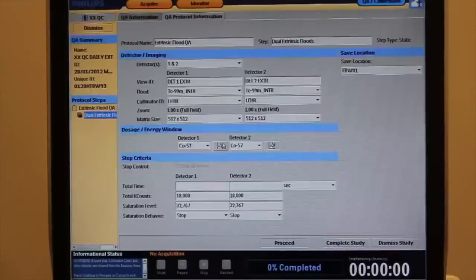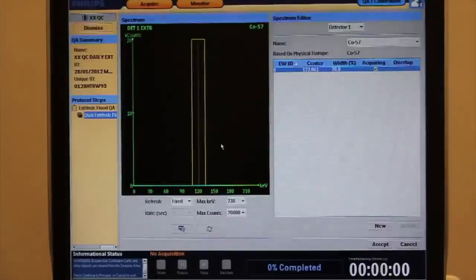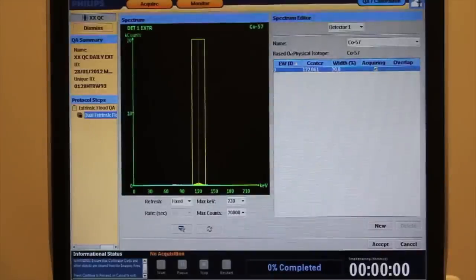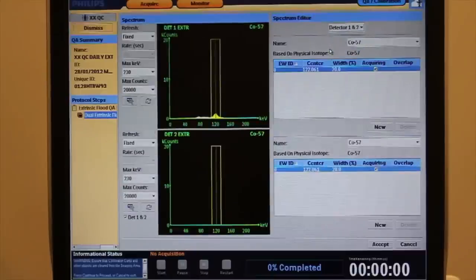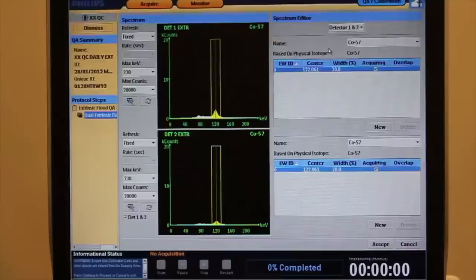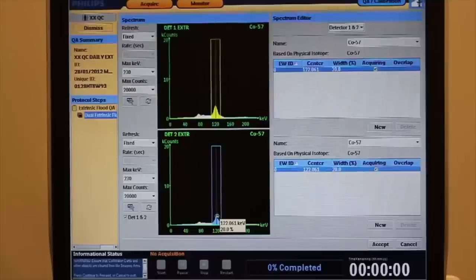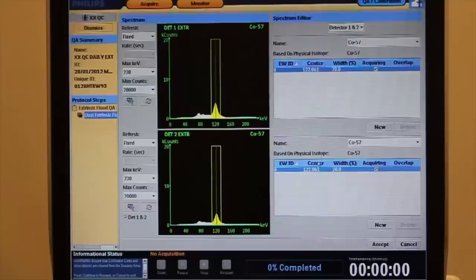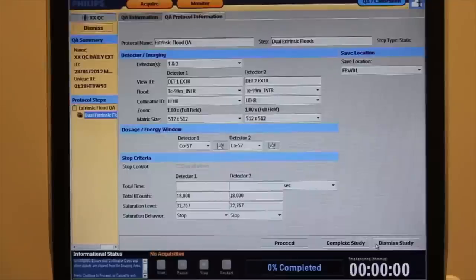From the main protocol page, enter the peaking feature. Choose both detectors. Confirm the position of the peak, numerical value, and visually confirm the position of the imaging window over the peak for each detector. Accept the peak if appropriate.